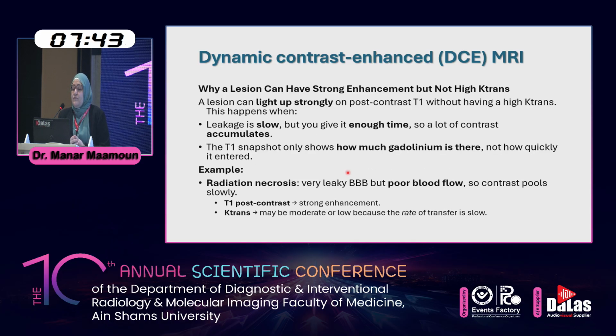A lesion can have strong contrast enhancement but not a high K-trans value, because the leakage in this case is slow. But it has enough time, so the contrast accumulates with time. It takes up contrast, but in a delayed manner, like radiation necrosis.